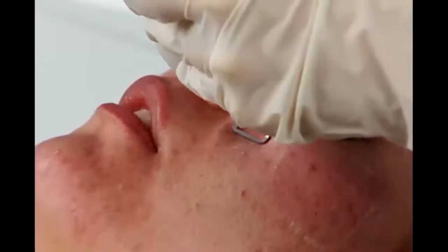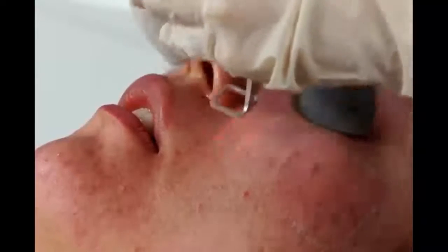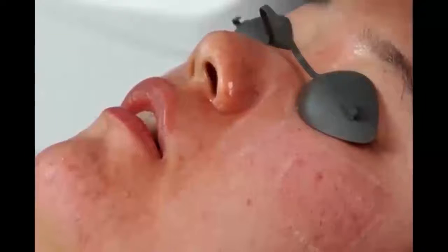During the operation, you can ask your patients how they feel, and you can adjust the parameters according to the status of their skin.